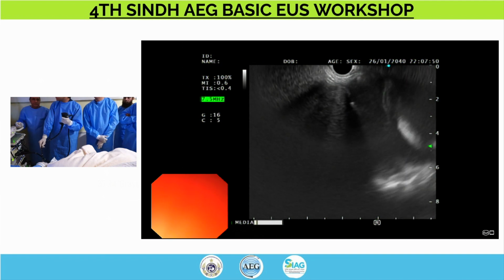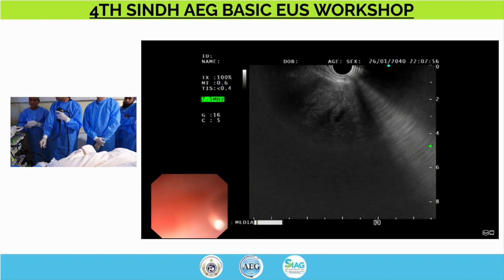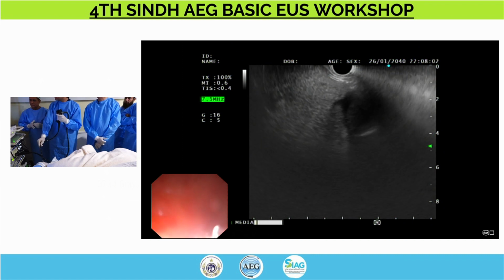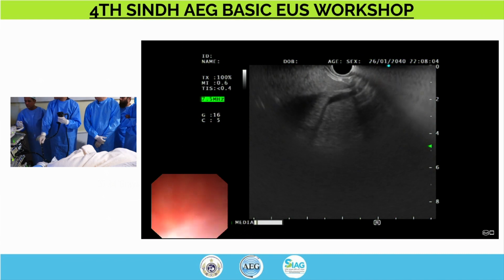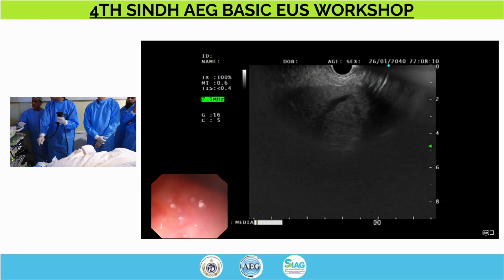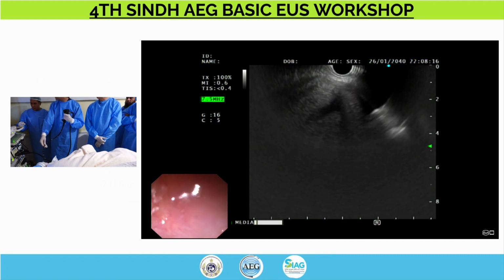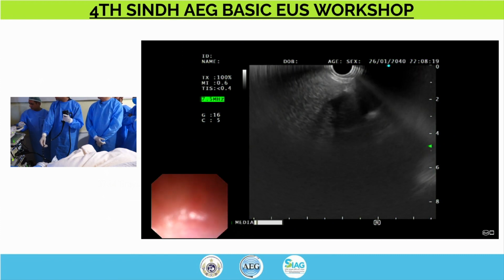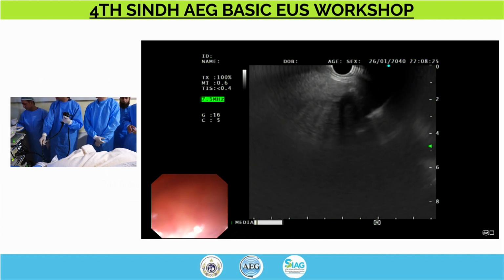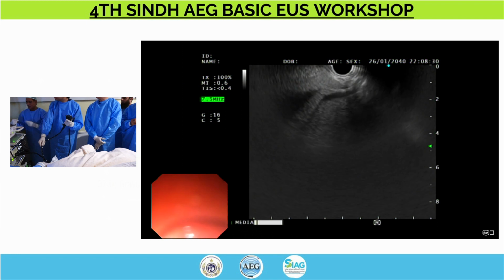Although you know that the case has been referred to you for cirrhosis of liver, you apply the complete clinical methods of your GI tract and rest of the examination. Similarly, in EUS examination as well, you have to apply the clinical methods, and that is the station approach. In the station approach at the GE junction, you have to identify the abdominal aorta. And in relation to the abdominal aorta, you have to look at the structures step by step from the abdominal aorta to the celiac artery, from celiac artery to the pancreatic duct, and from pancreatic duct to the tail and to the other side.